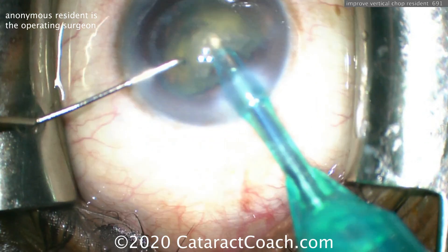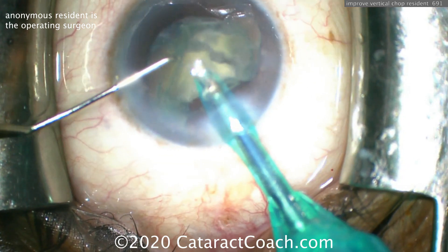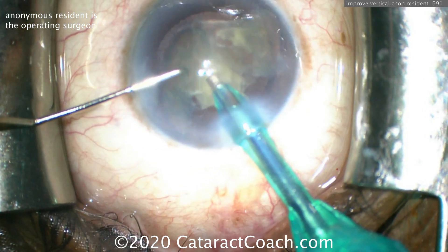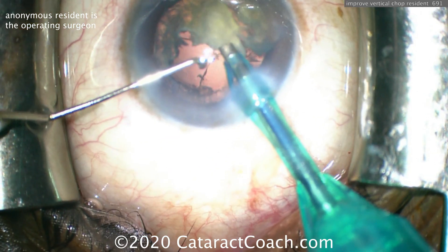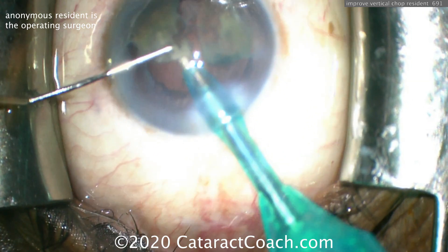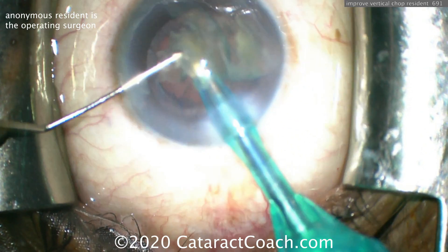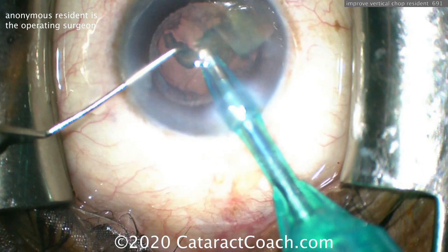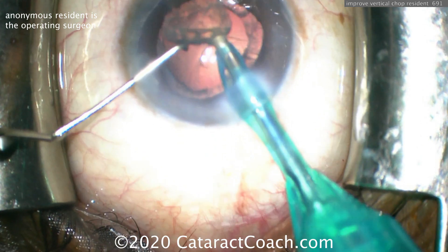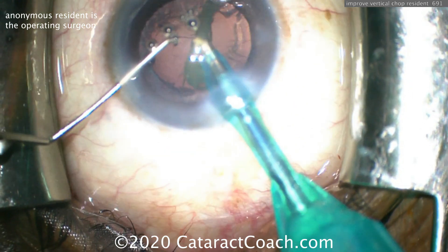Pretty good taking out the last bit of the nucleus. This resident has great hands. I like the position of the eye — it's pretty good. Good draping, lashes are out of the way. Look at the phaco incision — it looks pretty good. Nice architecture, nice square incision there, no chevron sign. Now be careful: as you remove the very last bits of nucleus, you have that surge going on. Make sure the posterior capsule isn't coming up. Be very careful when aspirating this last little bit of nucleus — maybe put that chopper in the safe position.